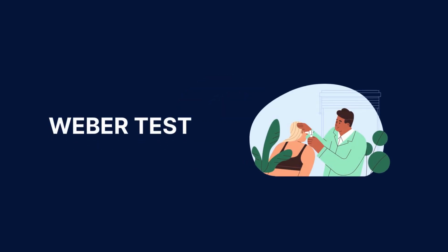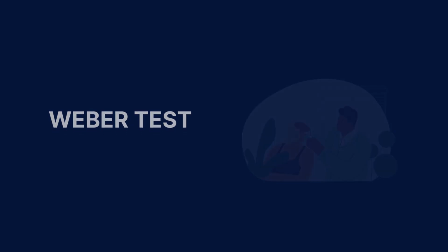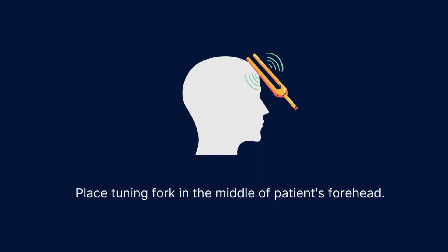Firstly, have your patient sit down and do the following. Ask your patient which ear is affected. Hold the base of the tuning fork. Softly strike the tuning fork's tines on your elbow or knee and make it vibrate. Place the tuning fork right in the middle of the patient's forehead or in the middle of the vertex. Make sure that the fork is touching the skin.